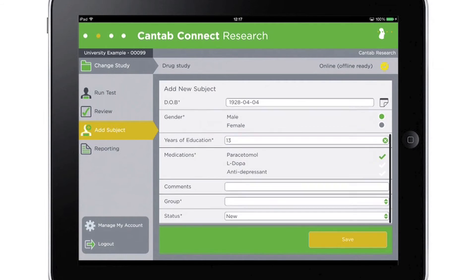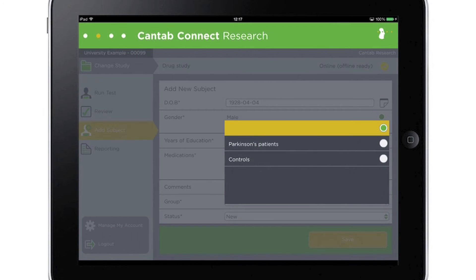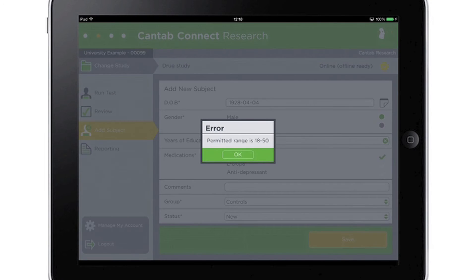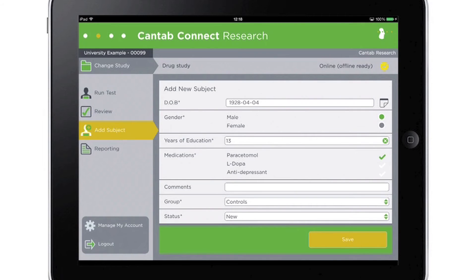To ensure any inclusion and exclusion criteria are adhered to during a study, users can set limits on the demographic details in Cantab Connect Research. For example, in this study participants under 18 are excluded. If a subject who is under 18 is entered into the study, a notification message is displayed. This functionality can also be applied and configured on a per-study basis.